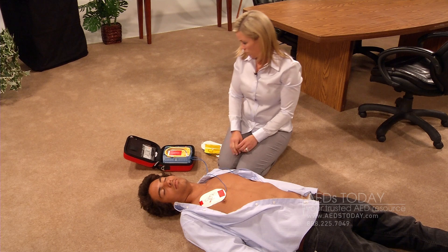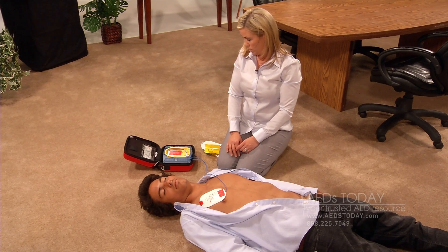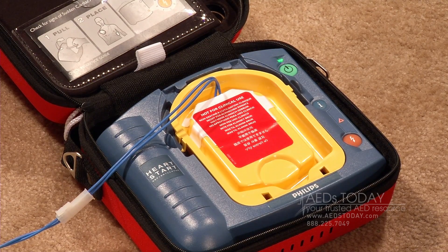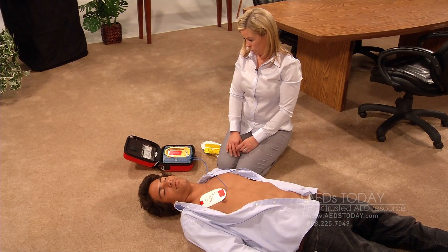As soon as the pads are in place, the AED will immediately start to evaluate the heart rhythm. No one should touch the patient. Analyzing. Shock advised.